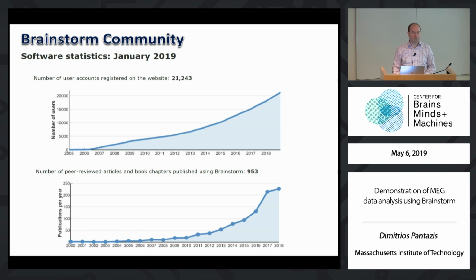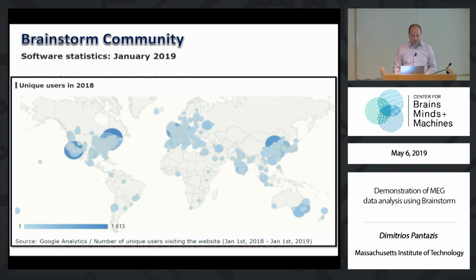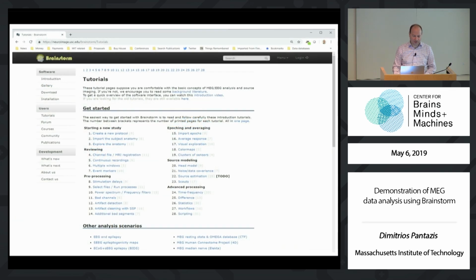Brainstorm is one of the popular tools, and I've been involved in the development since I was a PhD student in that group at USC with one of the principal investigators, and that's more or less why this is my software preference, because I'm most familiar with it. Users are worldwide using this software, and it has very good support and website, including tutorials. So what I will be discussing here is something very brief, but for those of you interested in learning more, there is a rich source of tutorials online for people to use.